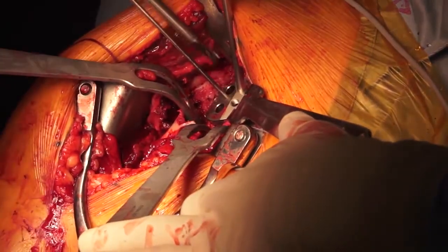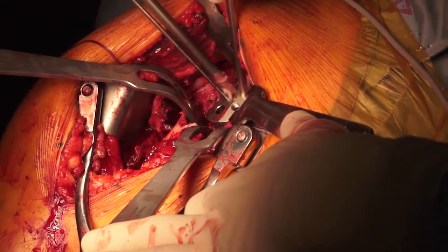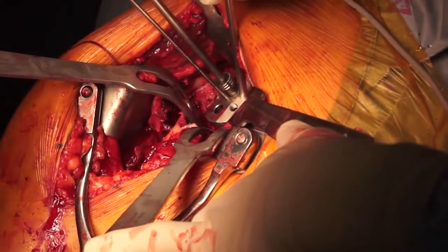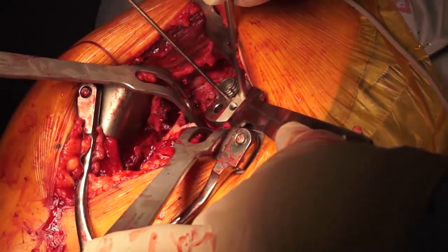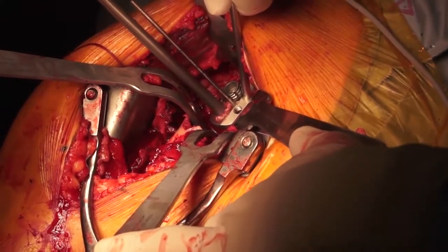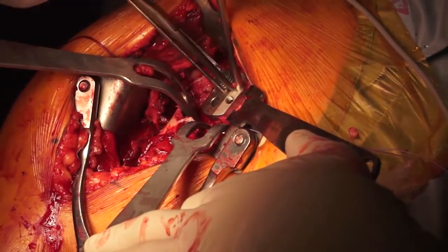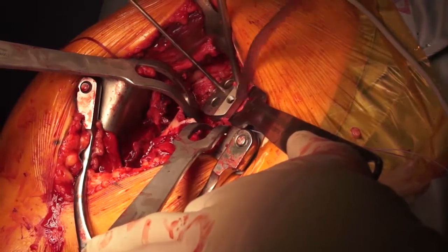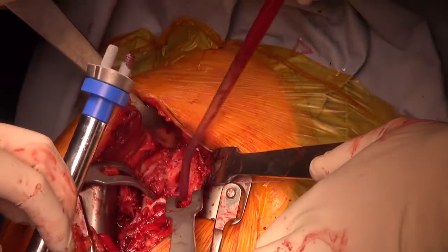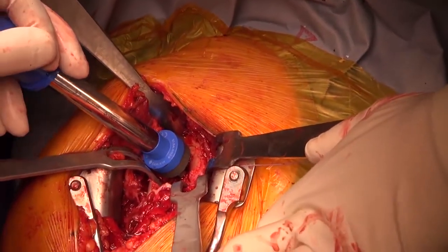The first hole is drilled for the superior anchor peg of the metaglen. To prevent rotation, a fixation peg is used. The second hole is then drilled for the inferior peg. The two-pegged metaglen is impacted until it sits stable, directly against the glenoid.